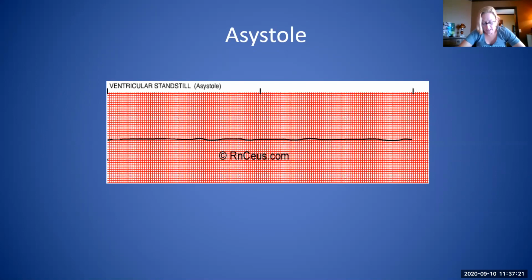So with asystole, though, you really need to try and potentially rule out other problems that might be able to be corrected to help bring them back. So those things that we consider are our H's and our T's. Our H's are hypovolemia, hypoxia, hypothermia, hyper or hypokalemia, and hydrogen ion, which is our acidosis. So those are our H's.